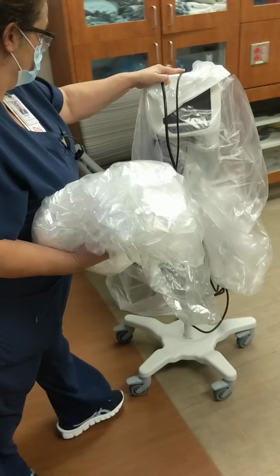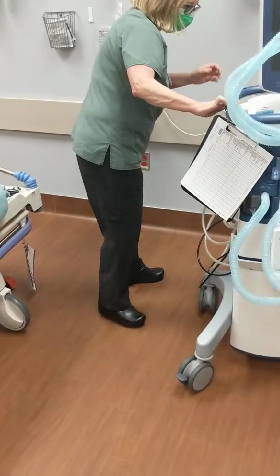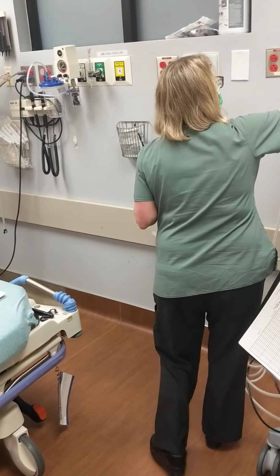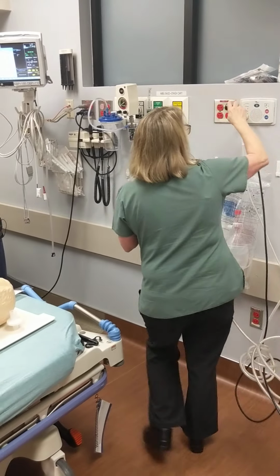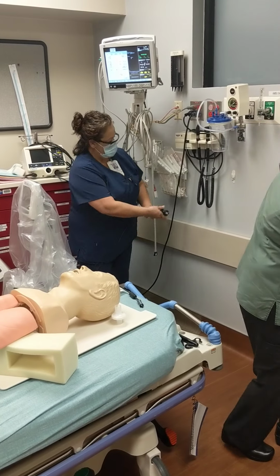And then we can do this methodically, just like this, so that everything's ready before we intubate. I'm going to turn on my vent and have it ready to go, so I don't have to use my ambu bag unless absolutely necessary. That'll decrease exposure.